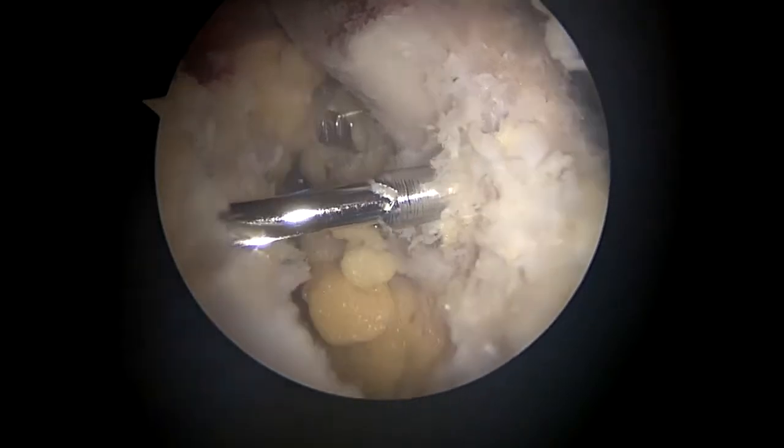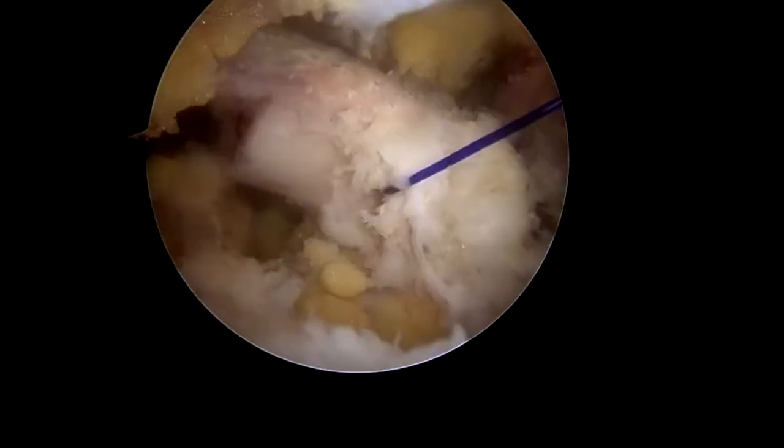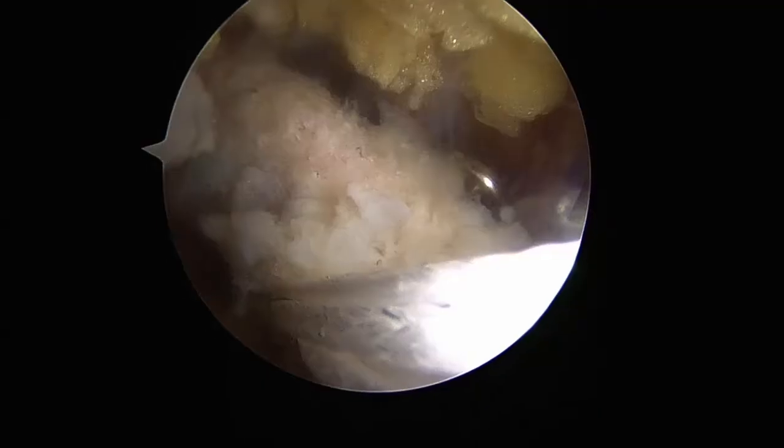A PDS shuttle suture is used to pass the bone-linked sutures through the coracoid process. The button is seated against the superior cortex. The sutures are then managed by placing them in the north portal.